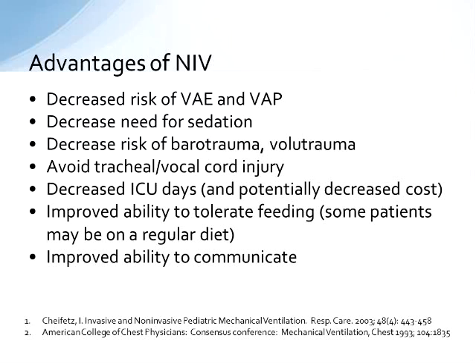As I mentioned in the previous slide, decreased ICU days, really associated with decreased ventilator days, which potentially decreases overall cost to the institution, which is certainly something that most institutions are very, very mindful of these days. Improved ability to tolerate feeding, so some of these patients are on a full regular diet and have no need to be fed via NG or tube feeding, so they can continue to eat as they like. And then improved ability to communicate.